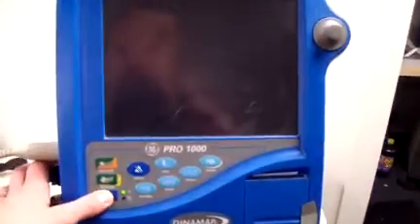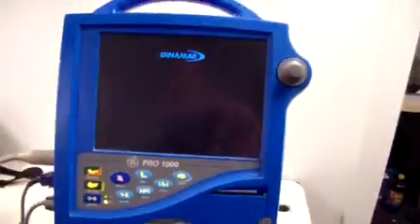Hey, it's Keith from DCSP Medical. We're looking at a DynaMap Pro 1000 patient monitor.